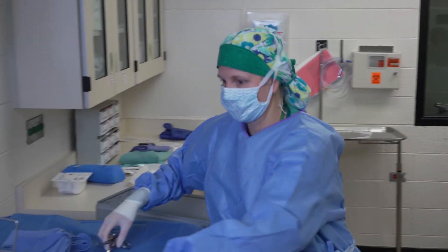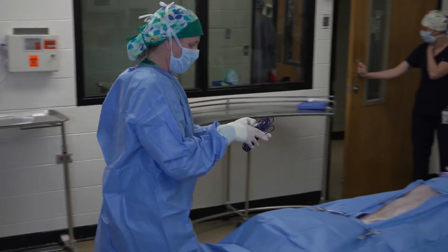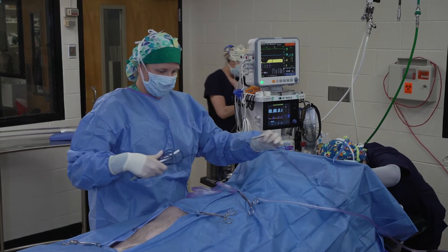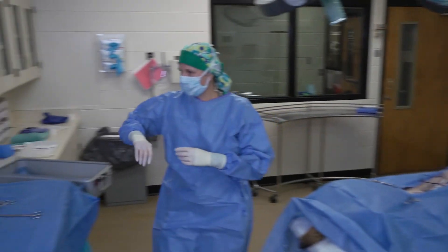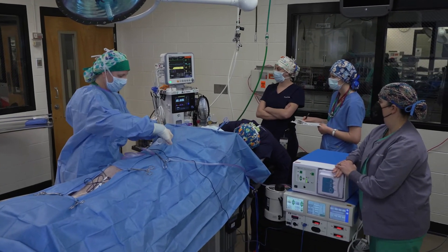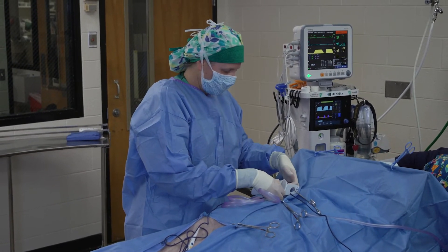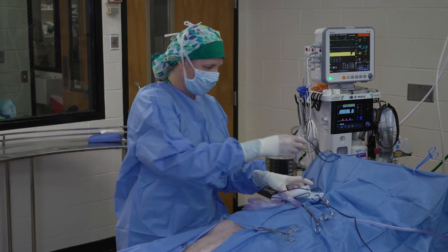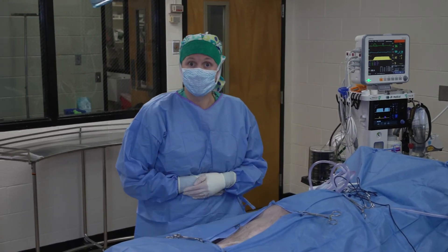Lastly, I just need to get my cautery handpiece hooked up. I'll toss the non-sterile end over. In this case I'm going to grab the little holster and secure it to my drape with a non-penetrating towel clamp, then hook the handpiece into the plastic holster to secure it. Now I have a little place for it to rest where it won't fall onto the floor. I can also pop the end of the suction tubing in there as well, and we're ready for surgery.